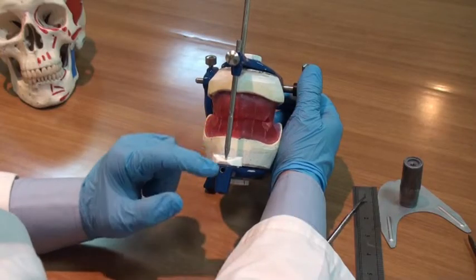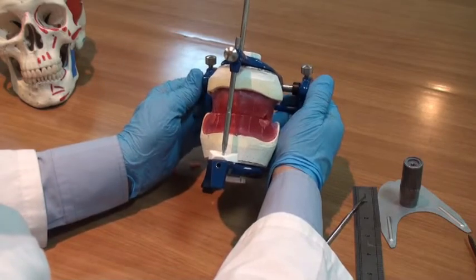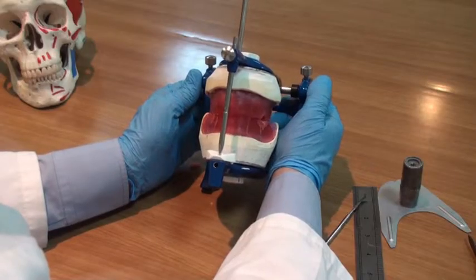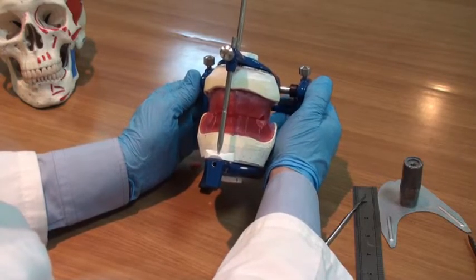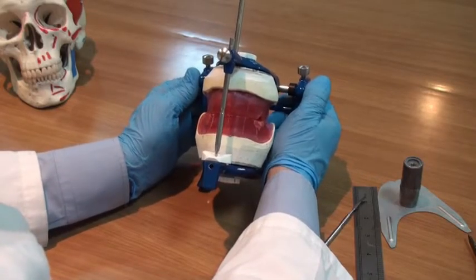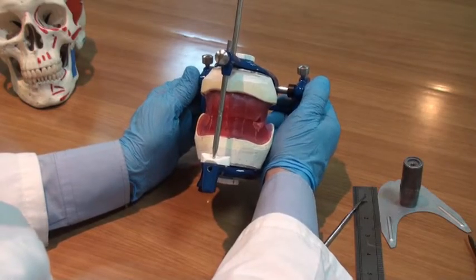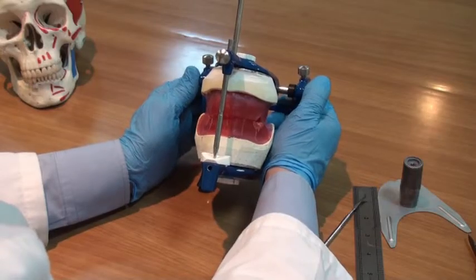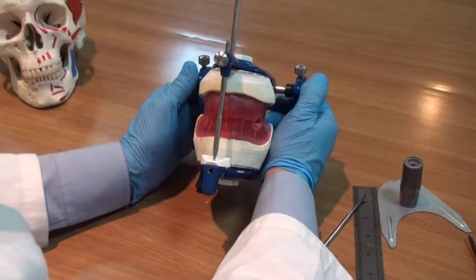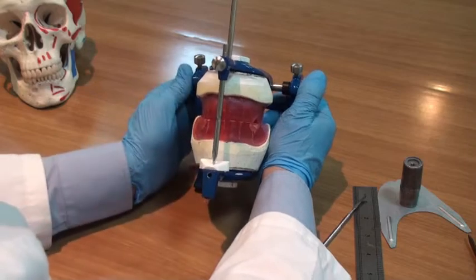of the incisal pin and the incisal guidance table. In protrusive movement, there is no separation. In lateral movement, there is no separation. And when we perform the setting of the lower anterior teeth and create the incisal guidance angle, this relation must be maintained. In this situation, we can say that the incisal guidance angle created by the setting is exactly the same incisal guidance angle designed in the articulator.